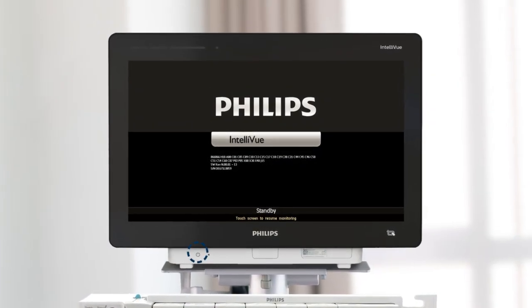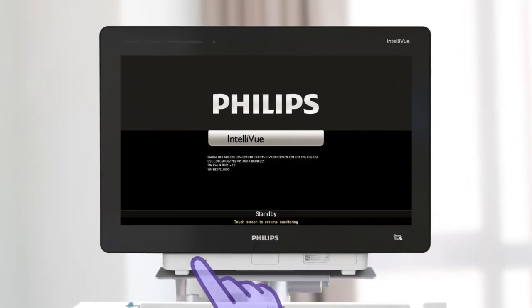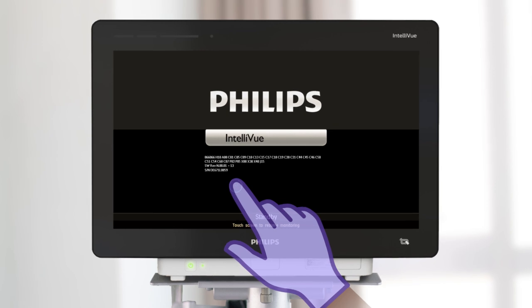To begin, press the power button to turn the monitor on, or touch the screen if the monitor is in standby mode.